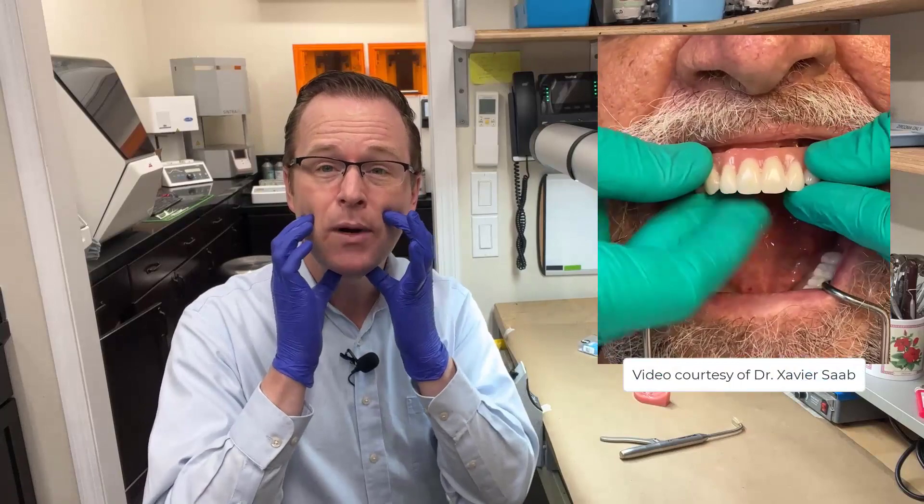So then you say to me, but how do I insert this prosthesis? I recommend going ahead and just trying it with your fingers first — taking your prosthesis, snapping it into place. Once you've tried snapping it into place, have the patient bite into occlusion, and then you can use a couple of other little aids to ensure that your prosthesis is fully seated down all the way.